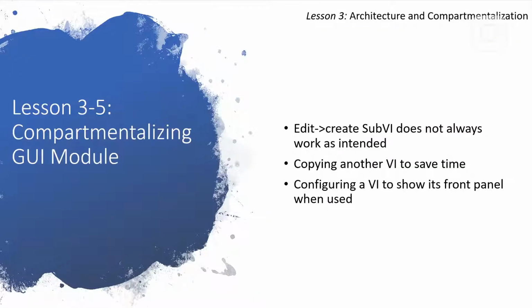Today, we'll do it with the GUI, but it's not as straightforward because we have a lot of controls and indicators. Instead of using edit and create a sub-VI, we'll copy another VI and just place it inside. We will also configure the VI to show the front panel when it's run, because all of the interaction for the user will be in the GUI VI. This is what needs to be in front, not the launcher.